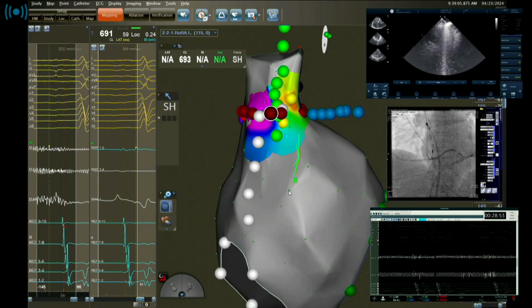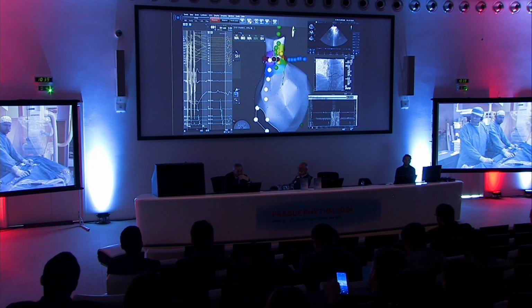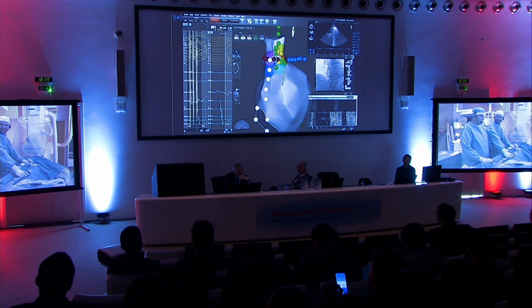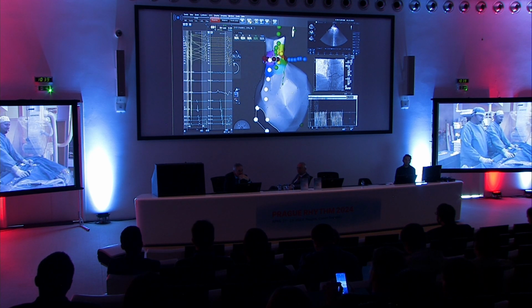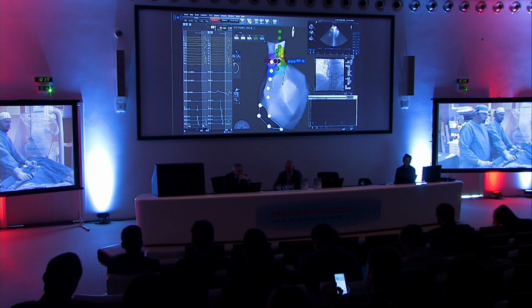Can I have a comment, Dan and Joseph? My personal experience with the Galvanize system is a little bit problematic because, as you might know, the very first and very unique esophageal lesion by PFA was only done by the Galvanize system, which means that the PFA you deliver through the catheter is not trivial.